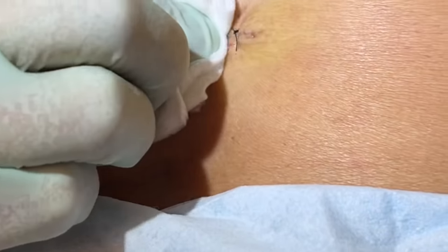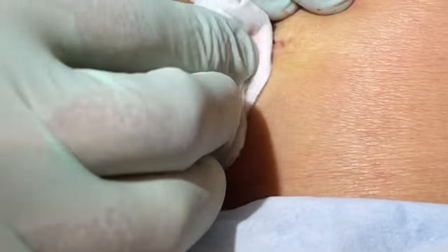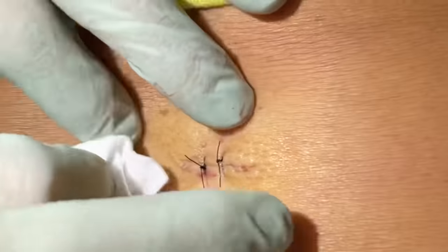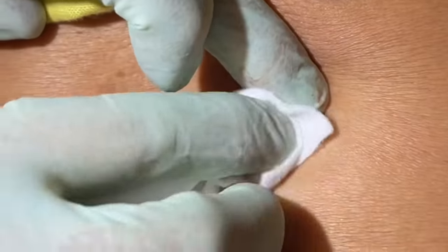Put a little pressure bandage on there and then just two stitches. We'll go 10 to 14 days. And that will be nice — that whole thing is gone, that'll never come back.